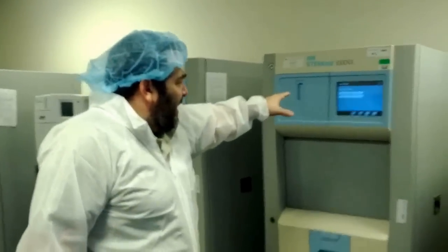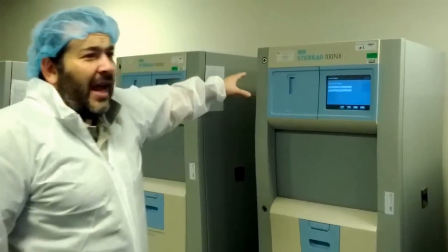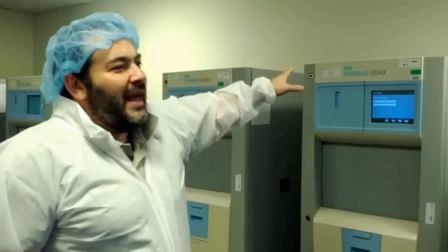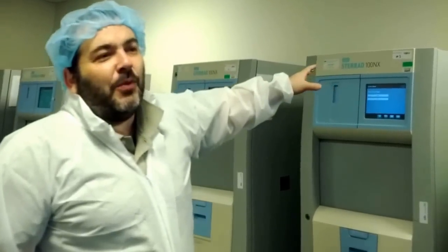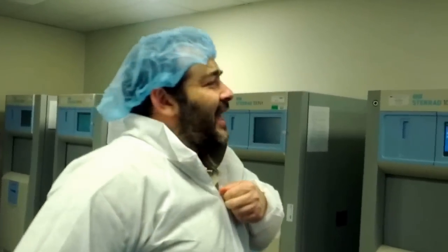All of these machines do the same thing. They rely on a deep vacuum draw as a first cycle, then introduce an H2O2 mist. Once it permeates everything inside, they zap it with a radio frequency to turn it into a plasma. After it interacts with the instruments and destroys all microorganisms, they pull the vacuum again to clear out all residual H2O2.